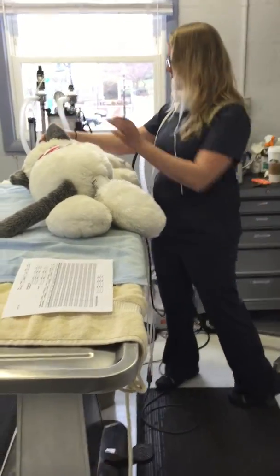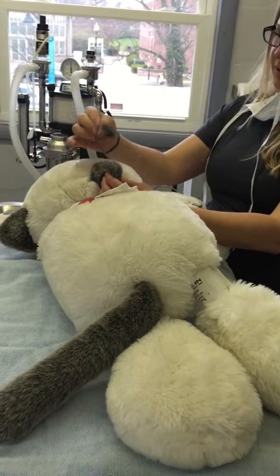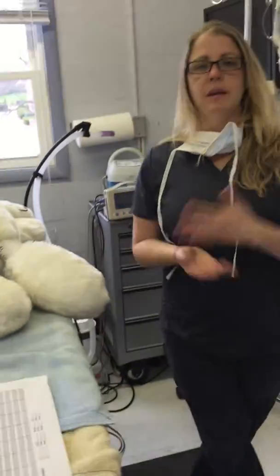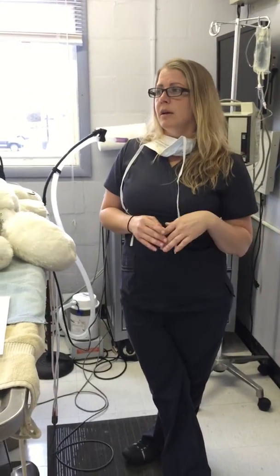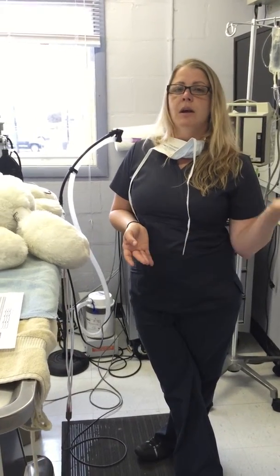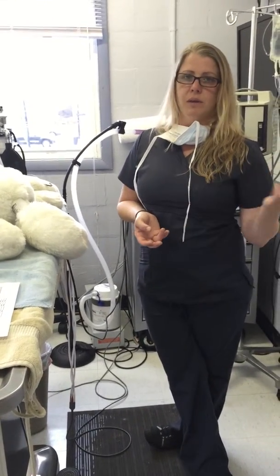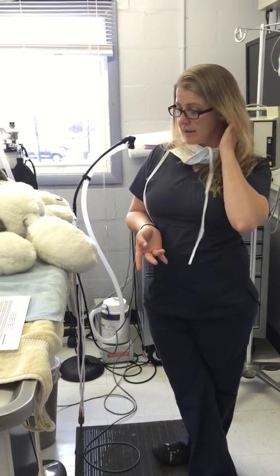I have a pulse oximeter, and for this patient, since he doesn't have a tongue, we're going to use his ear just to demonstrate another place that we can use it. We could also use a toe. For our pulse ox, we like to keep everything above 95. Once we drop below 95, we're looking at poor oxygen stats, which could be shown by bad circulation, not enough oxygen perfusion to all the rest of the body and tissues, which can cause issues under anesthesia as well, with the isoflurane gas not getting to where it needs to go, and not a lot of carrying capacity.